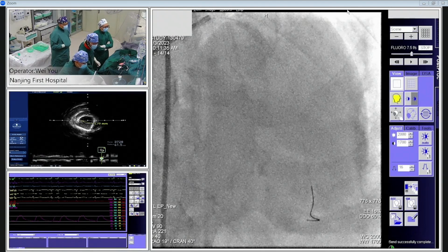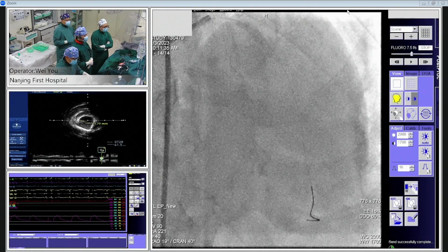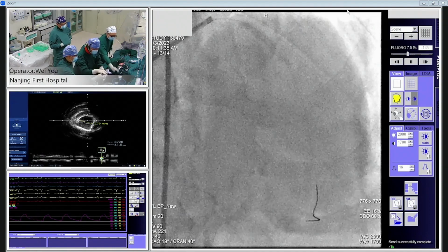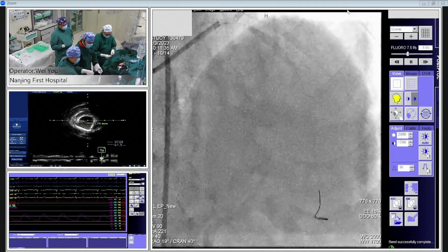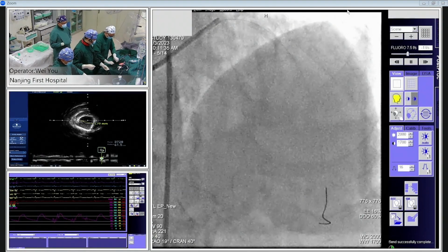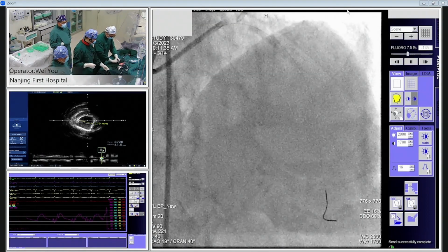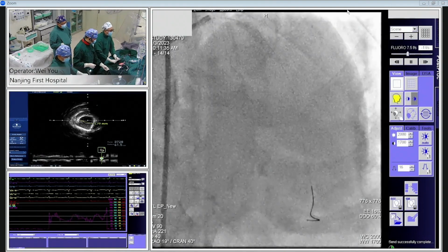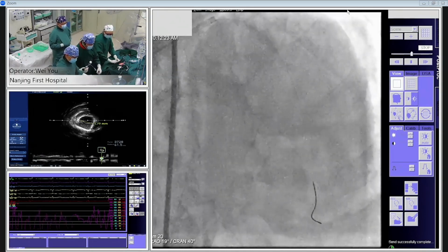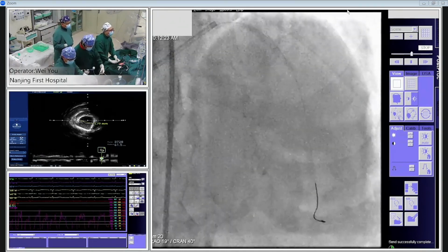Yeah, we agree. Dr. Fan just calculated the vessel diameter. 3.0, just the reference vessel size. So next step we'll do the IVL treatment with a 3.0 shockwave balloon. It's a typical combined treatment, with rotablation and IVL treatment for this severe calcification before we put a stent.